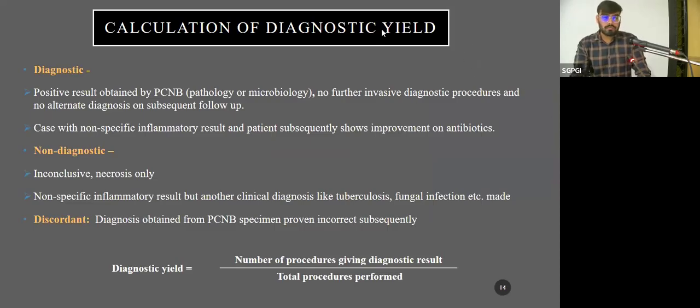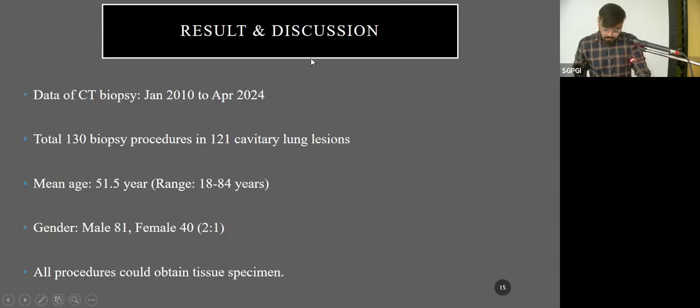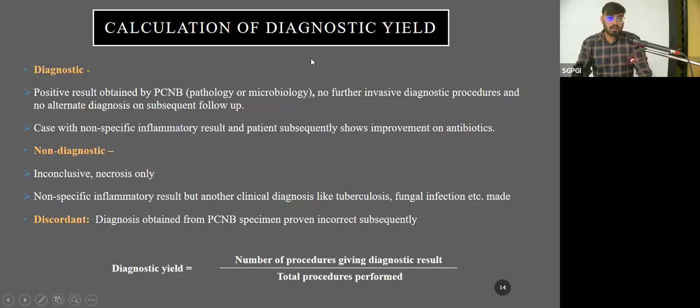Now, we will see the meaning of diagnostic yield. We will consider our procedure diagnostic if a positive result is obtained from our biopsy procedure, no further invasive diagnostic procedure is needed, and no alternate diagnosis is seen on subsequent follow-up.